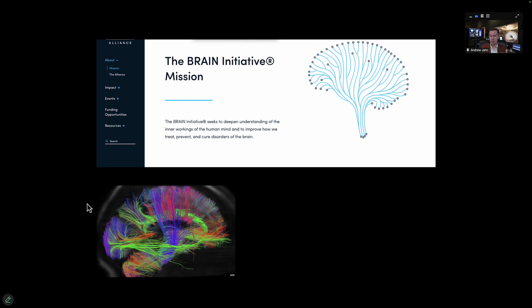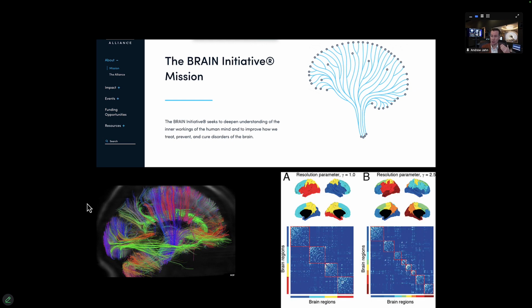So this involves things like connectomes as far as structural data. For example, in the bottom left here, you can see white matter tracts, which are color-coded according to their main orthogonal directionality. And you also have something on the bottom right indicating functional connectivity, which strictly speaking might not be connectivity. It's more correlations between the BOLD signal between different regions of the brain.